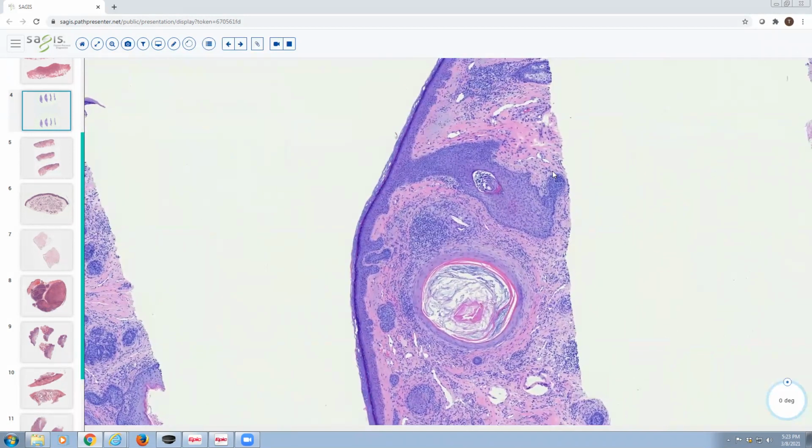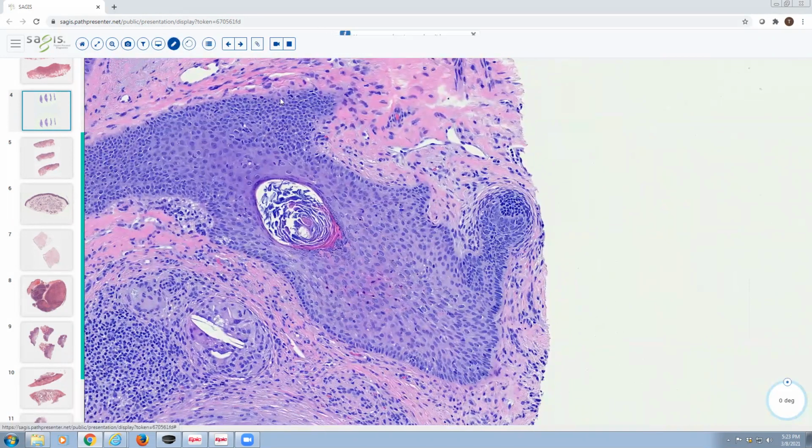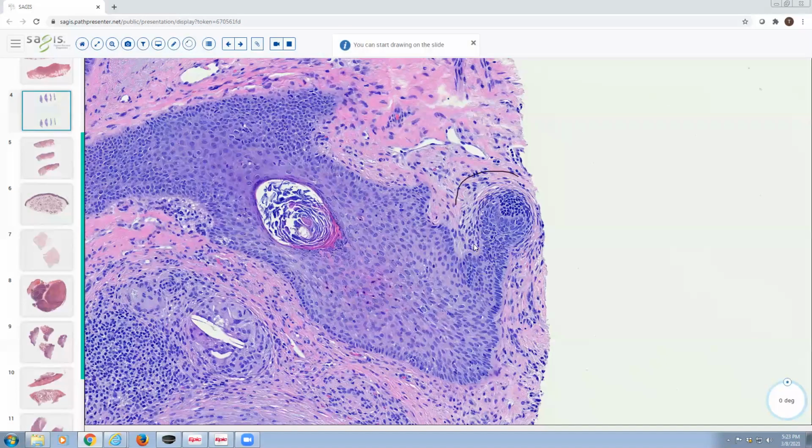So this is a good example of what a papillary mesenchymal body looks like. You have this cup of epithelium. Here's your little cup-shaped proliferation of epithelium, and then within that cup is a cluster of loosely organized primitive mesenchymal cells. This is like the hair papilla. If you go back and look at this normal hair anatomy, this is recapitulating the papilla of the hair.